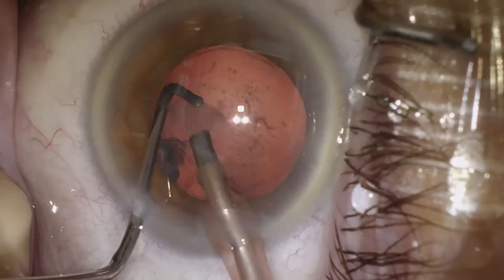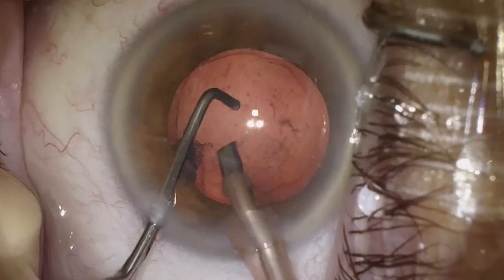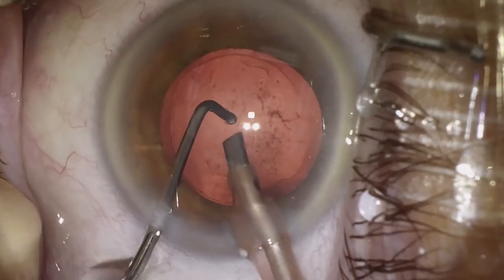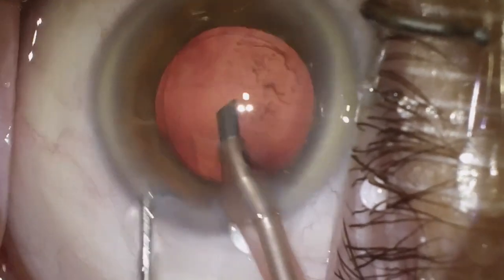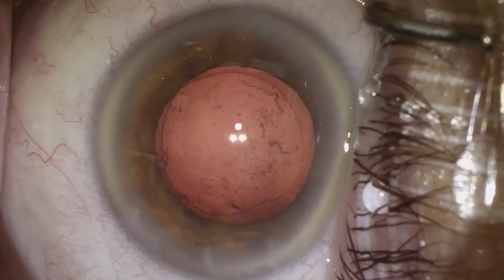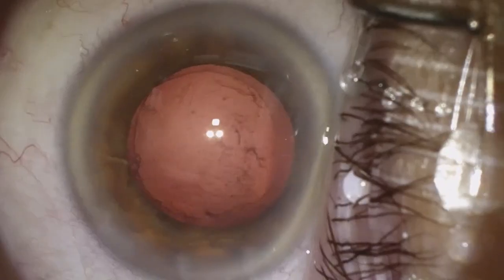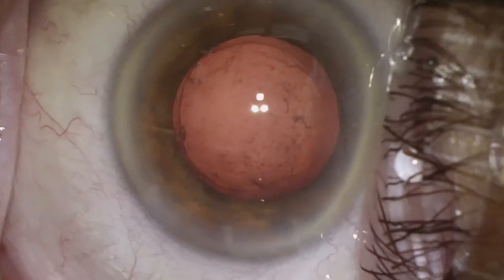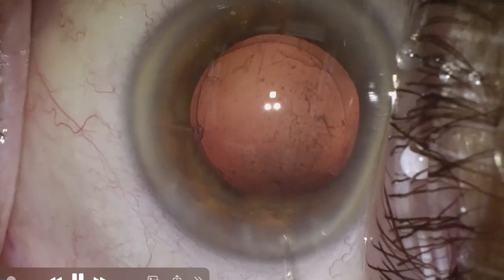Good. Very good. And that cortex comes out nicely just with the phaco probe there. Because of the cortical cleaving hydrodissection, that cortex is not densely attached. It's hard to tell in this view. It looks like the posterior capsule has all sorts of things on it, but that's actually the lattice dystrophy from the cornea. That's what's obscuring our view here of the posterior capsule.